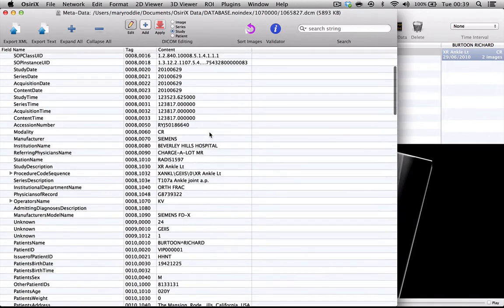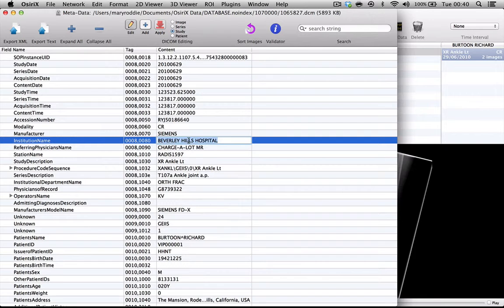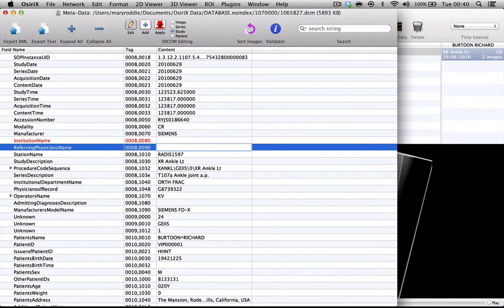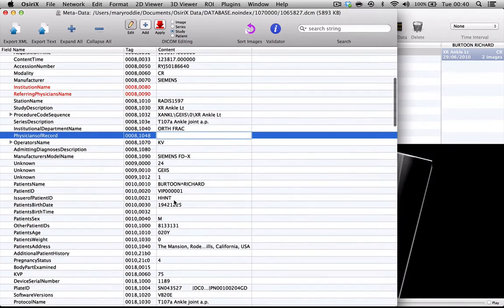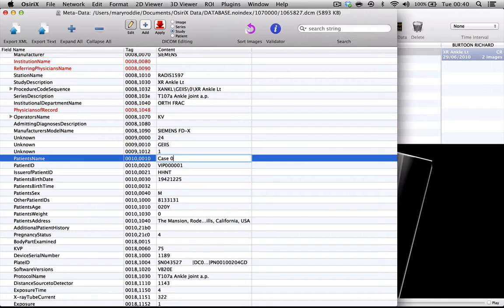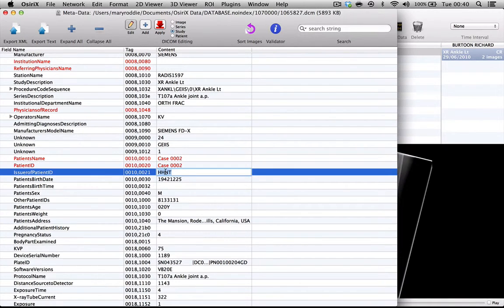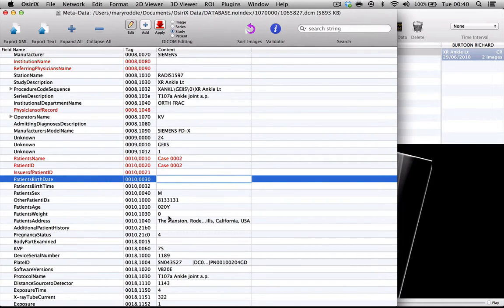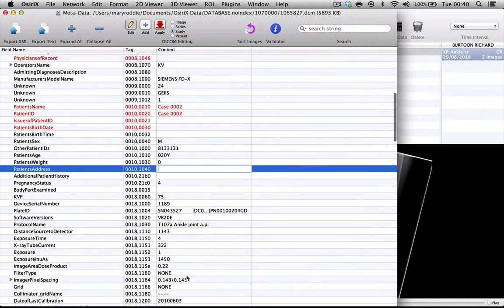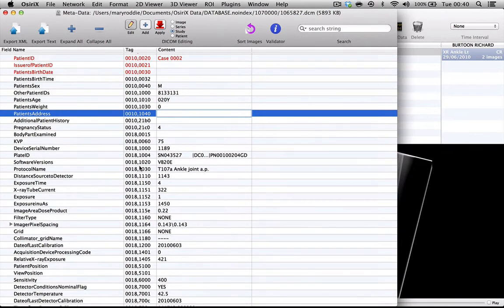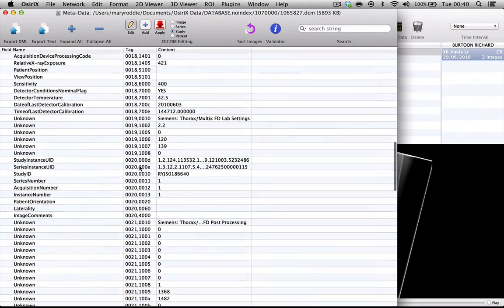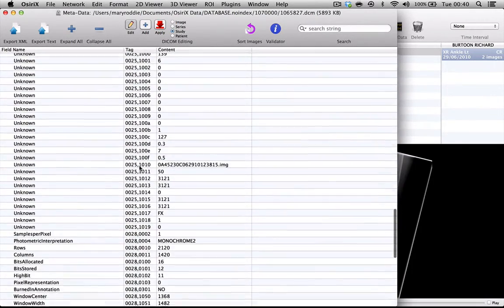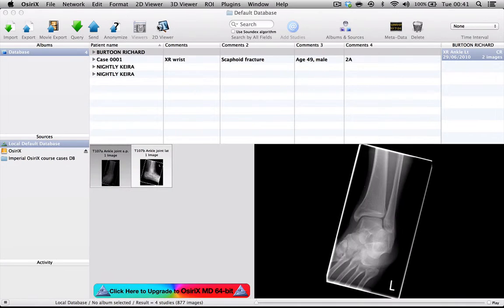If we now look through this list of information, the first thing I see is the hospital name, which I'm going to get rid of, as well as the name of the very expensive surgeon. This is a physician number, which I'm going to get rid of. Now I'm down to the patient name. We're going to call this case 0002 and I will call the ID the same name. I'll get rid of that because it identifies the hospital. I'll get rid of the patient's date of birth. I'll leave the patient's age, which is 20. I'll get rid of the address. I'm now coming out of the 0010 numbers, so it's less likely that there will be anything incriminating below this level, but I'm just going to look down to check. There doesn't seem to be anything else there.